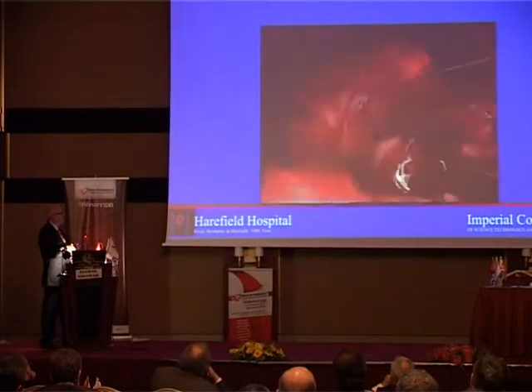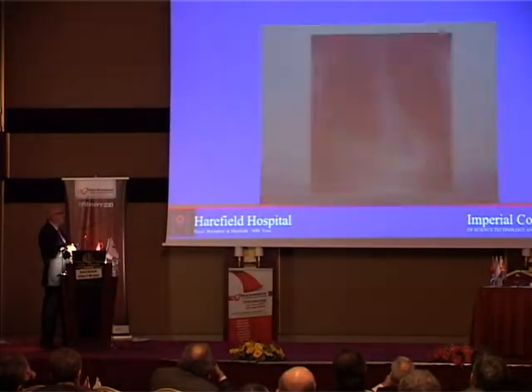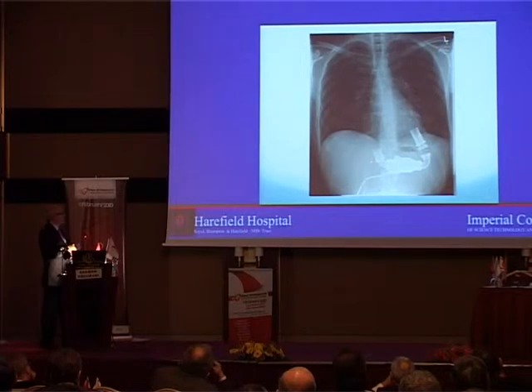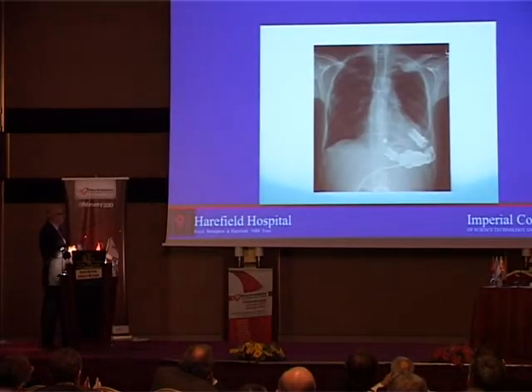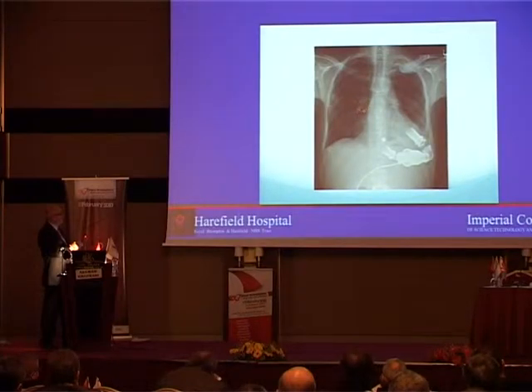Showing the closure of the apex. And you can possibly appreciate that the tissue there is very tough and very easy to close. And after that, then we want to go to that area and pull this section out and cut the drive line, and then at the end of the operation, when everything is closed, we pull the drive line out because it is divided here.